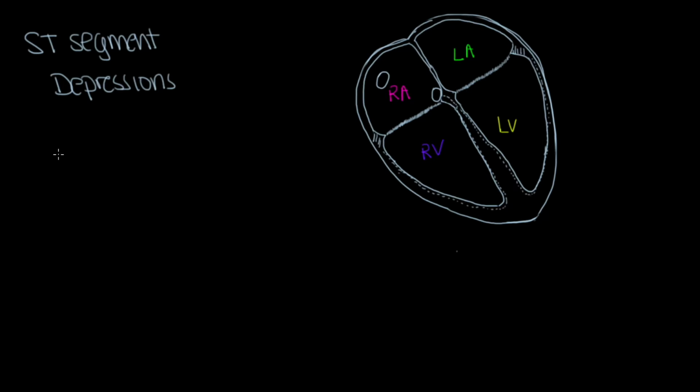So first, we're going to go over ST segment depressions. And the two things we want to go over for ST segment depressions is, one, ST segment depressions are a sign of sub-endocardial tissue ischemia.